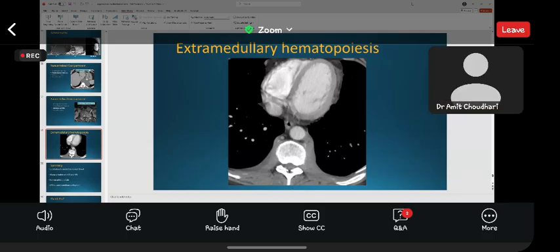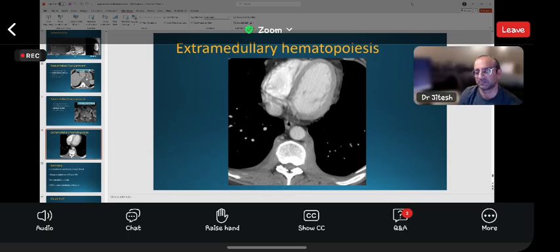Perfect. And can thymic carcinoma be differentiated from teratoma or germ cell tumor? Yeah, again, for non-fat containing germ cell tumors, age is important when we are making the differential diagnosis. We expect to see these non-fat containing germ cell tumors in patients who are less than 40, whereas thymic carcinomas are seen in patients in their 60s and 70s, right? Six or seven decades. I showed two examples. They look very similar. Both have lung nodules, right?